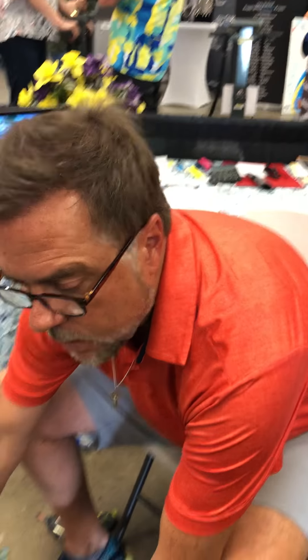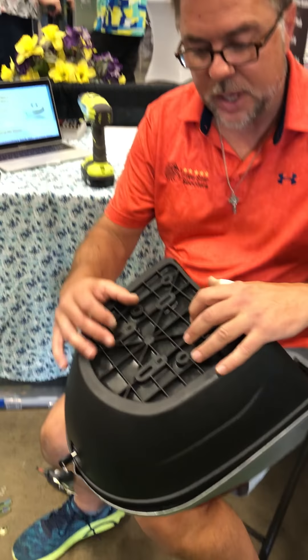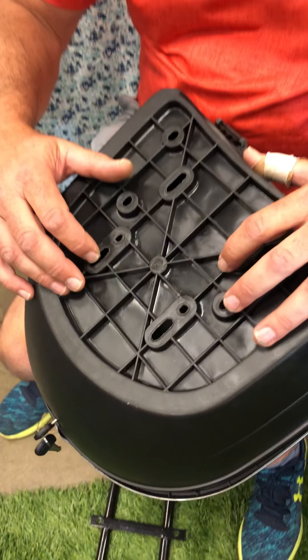I want to take a quick moment to make a video on how to modify your box back if you want it to be shifted back a bit further than the standard holes. Sometimes I get feedback that the box back makes folks feel like they're being pushed off the seat. Let me show you — these are the holes that you normally would use, the furthest ones forward.